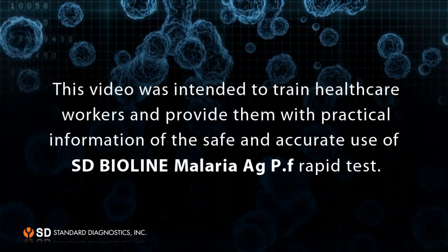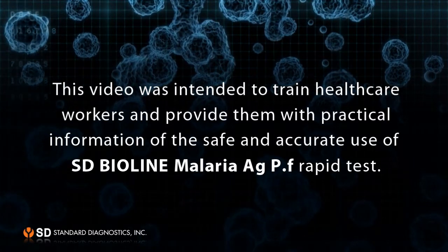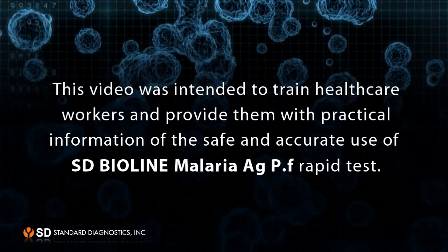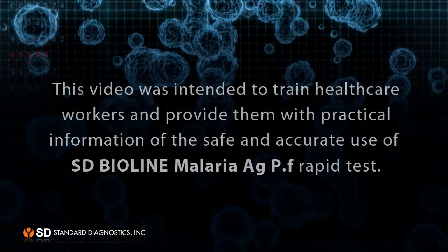This video was intended to train healthcare workers and provide them with practical information on the safe and accurate use of the SD Bioline Malaria Antigen PF rapid test.